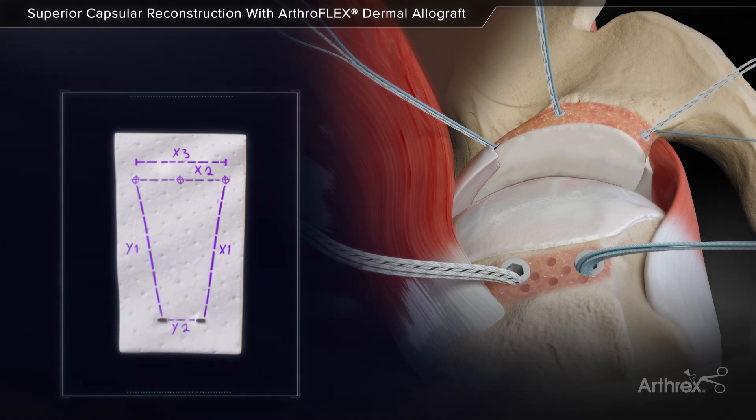These measurements are recorded and used to shape the ArthroFlex graft. Small holes are made in the ArthroFlex graft at the corresponding anchor locations of the fiber tape sutures to simplify suture passage and ease suture sliding when positioning the graft.